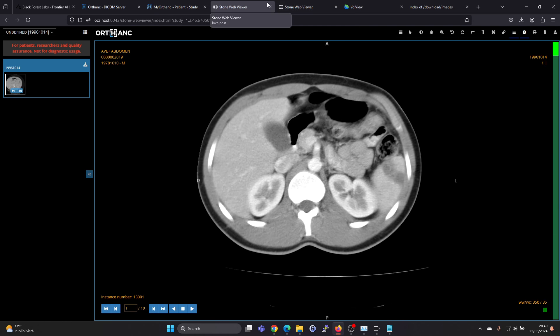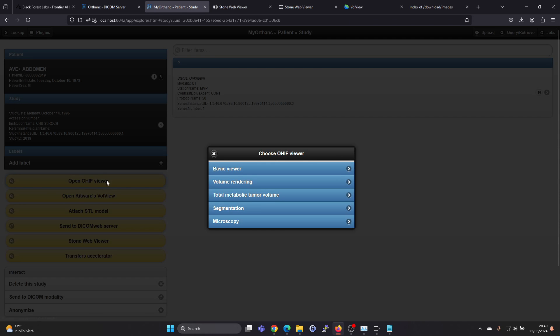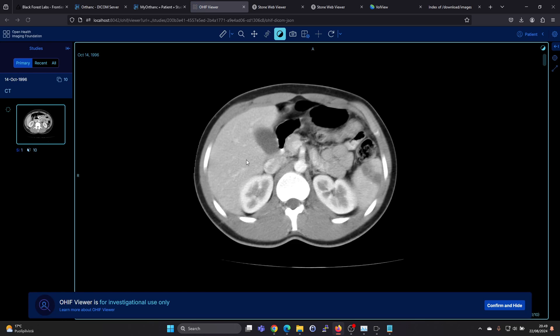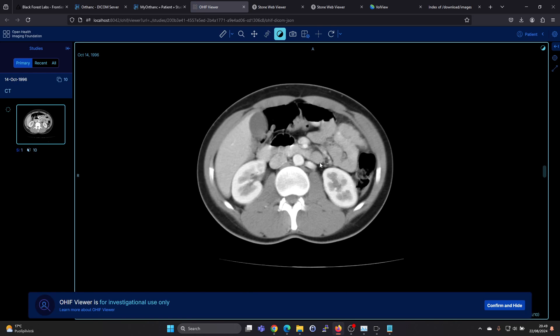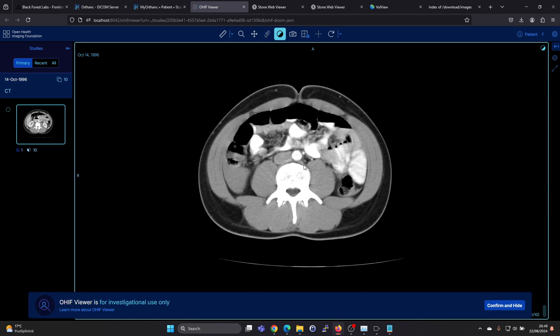I think the OHIF viewer is a great option. So it's really nice that it comes built in with this installer.